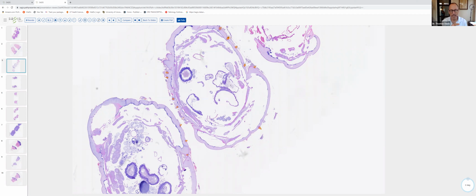And I'm sure, as many of you know, myiasis is caused by the botfly. The female gravid botfly actually grabs a mosquito, lays the eggs on the mosquito. The mosquito, when it bites the host, human or animal, the eggs will drop off, hatch on the skin surface, and then the larva will burrow down into the skin. So this is a botfly larva.